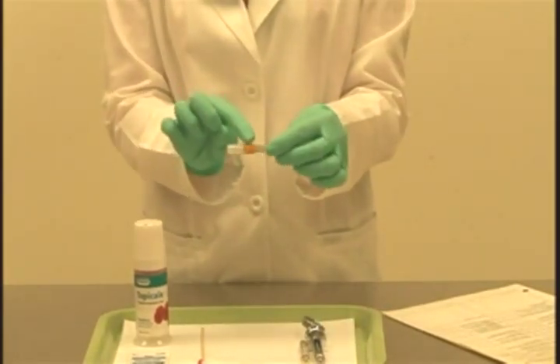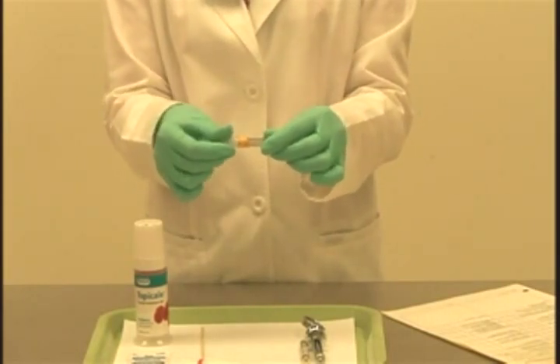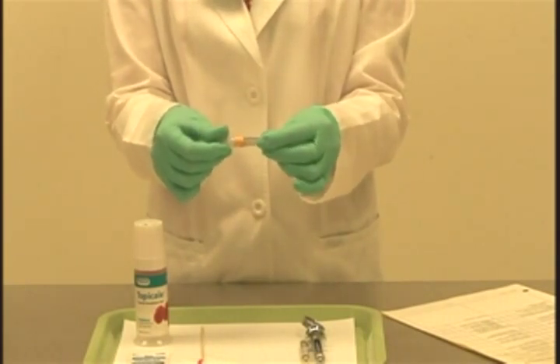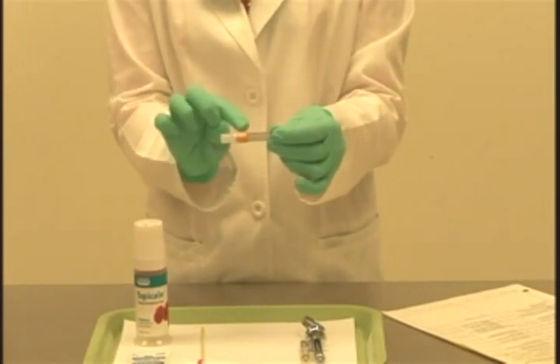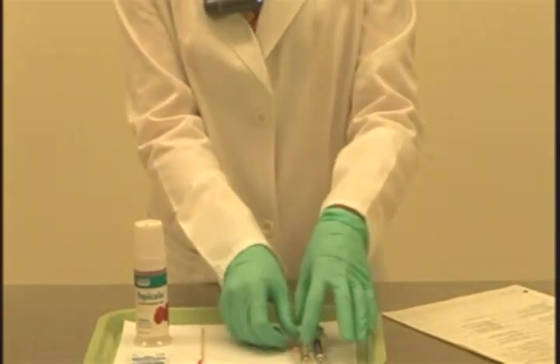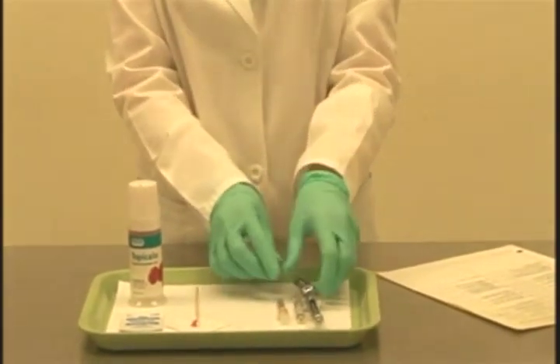In terms of our needle, we have a seal around the needle that we want to ensure is intact. Just gently twist either end — if the seal has been broken, it will be very evident. I can confirm that the seal on this particular needle is intact. As you check these items, you will be confirming with the clinician that everything is intact.